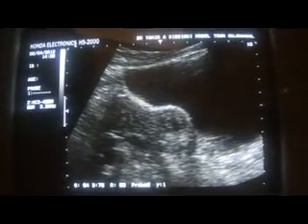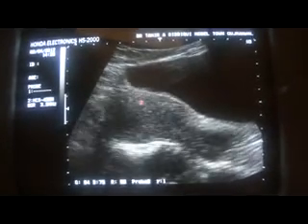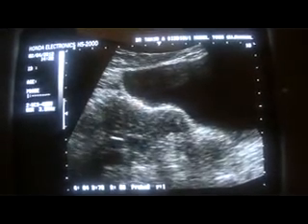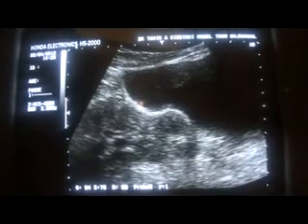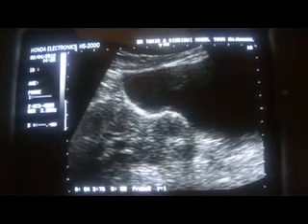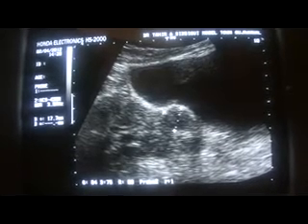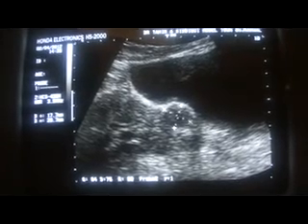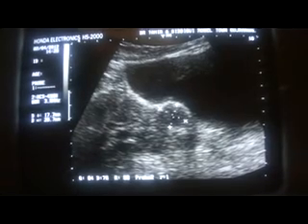This is the anterior wall of the uterus. When I angle the probe towards the left side, I come across this layer. If you see the uterus in this position, you cannot get everything — always see the anterior and posterior segments to rule out any focal lesion in these areas. This is the lower segment of the uterus, this is the fundus, this is the posterior segment, this is the focal area, and this is the cervix.